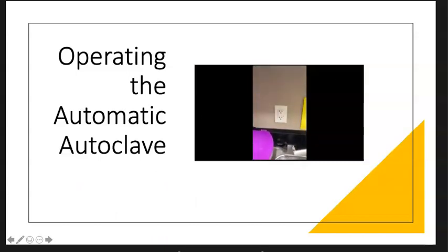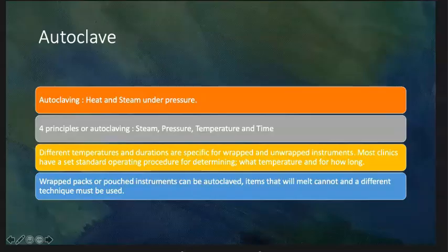That's it. It is very important to always handle your sterilized packs with care. Once the sterilization procedure has occurred and your packs are deemed sterile, it's important to put these dry packs away. Putting them into designated surgical pack cupboards is ideal as it keeps the dust, dirt, and debris away from them.